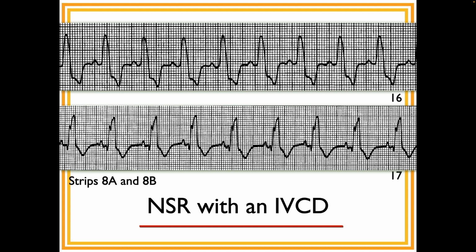So first of all, do you see why it's a normal sinus rhythm? Yeah, because it's regular. And what else? P waves. Okay, remember the P waves. In a little bit, we're going to start doing ventricular rhythms, and they're also regular, but they don't have P waves. Okay? So it's a normal sinus rhythm because it's got a P wave. It's regular. There's a P for every QRS, a QRS for every P. The P waves all look alike. Okay, the same criteria stands.